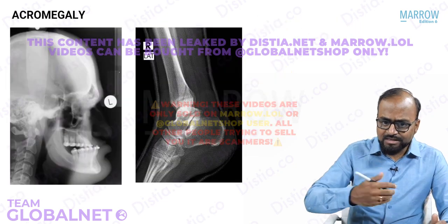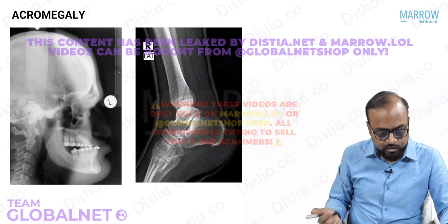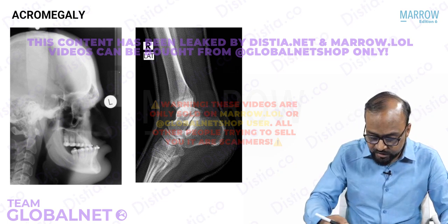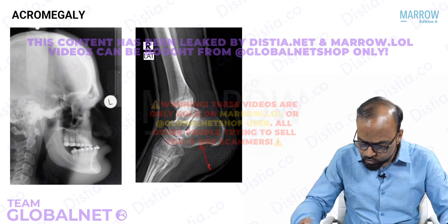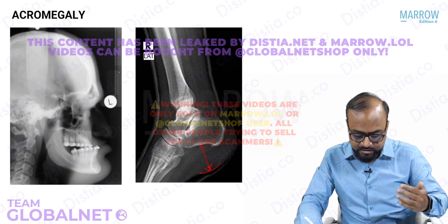Now, excess growth hormone secretion in adults will give rise to acromegaly. This again presents with a lot of imaging features. It can affect the soft tissue. So soft tissue thickening occurs on the body. This is prominently seen at the heel pad. The soft tissue of the heel pad just below the calcaneum gets thickened.